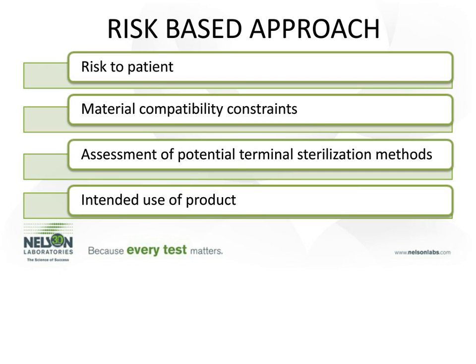And in association with that, an assessment of the potential of terminal sterilization methods for some of these combination products. Also, to be addressed would be the intended use of the product. Does it have patient contact versus non-patient contact, or direct versus indirect contact? So all of these concepts will be further addressed in an ISO document as opposed to just an AAMI document.